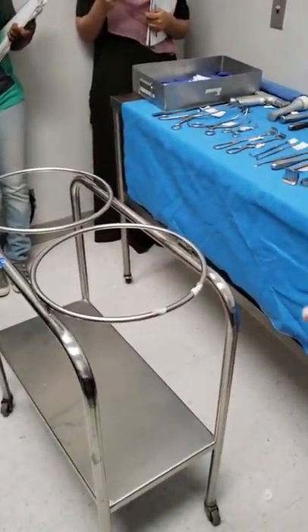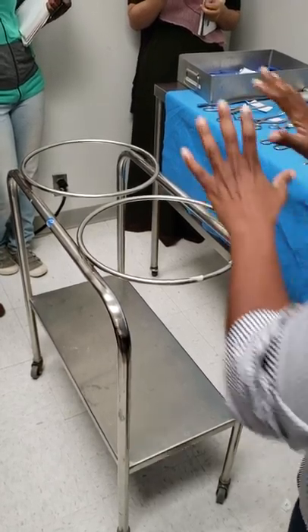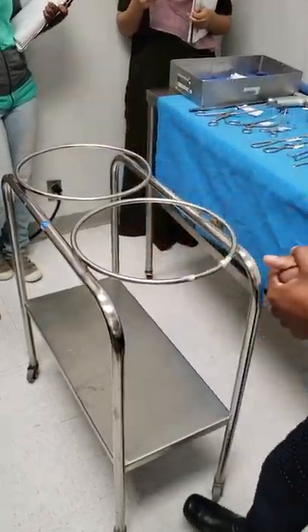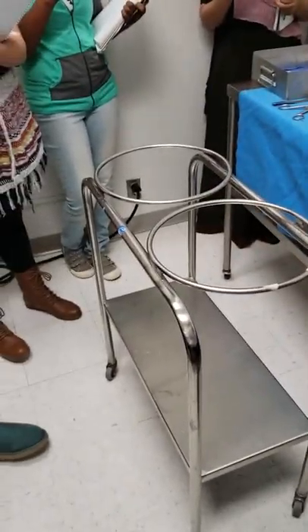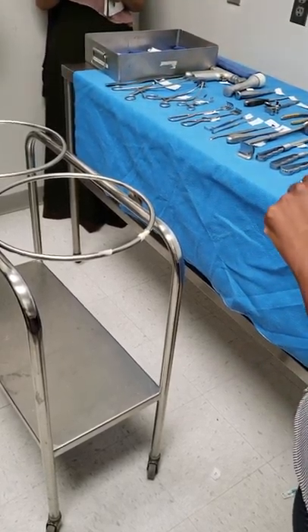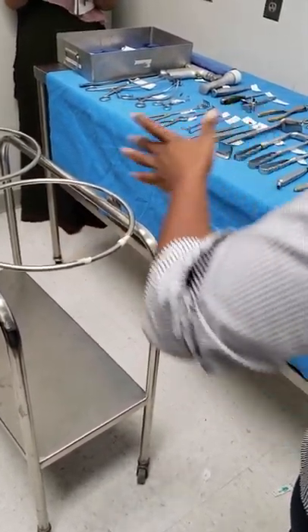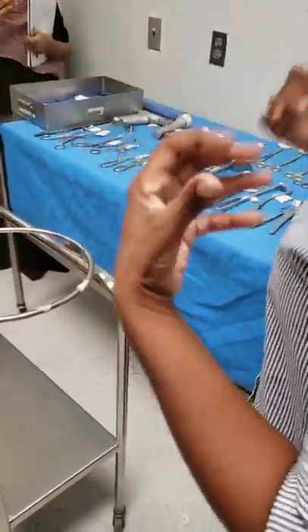So I placed everything where I'm going to open it, right? Mm-hmm. And I placed all my equipment where it's supposed to be. So this would have been my basin where I was going to open. Now I've got everything. Next thing I'm going to do is wash my hands, because I've touched everything. I'm going to wash my hands first. I don't know if it's been cleaned thoroughly.